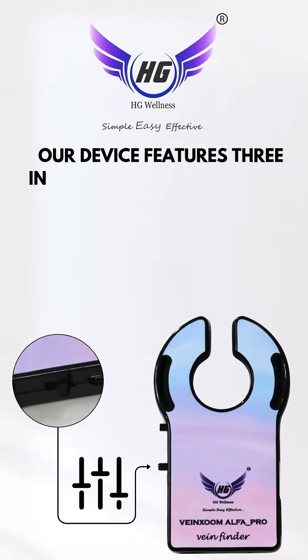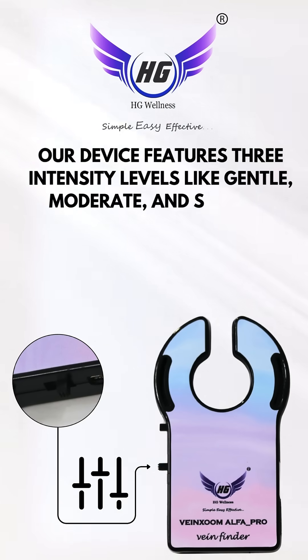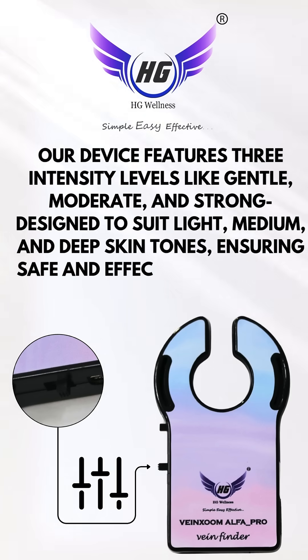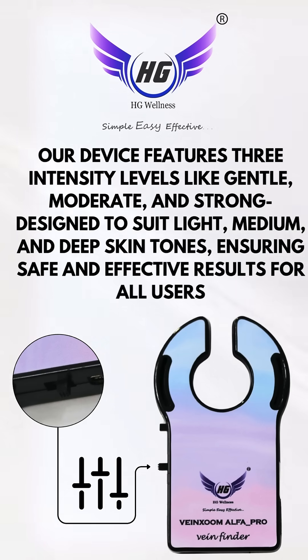Our device features three intensity levels — gentle, moderate, and strong — designed to suit light, medium, and deep skin tones, ensuring safe and effective results for all users.